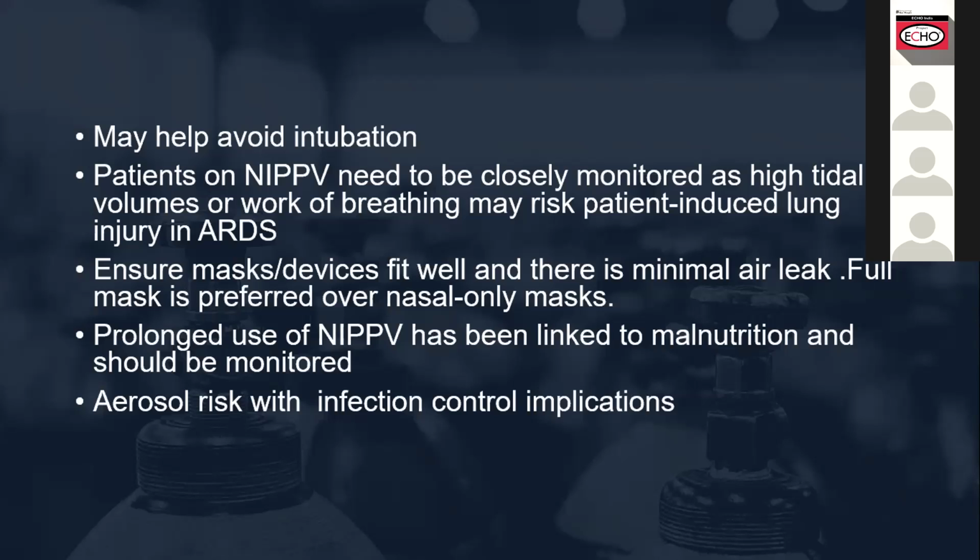Generally, you will prefer this method of oxygen supplementation if you judge it is going to be for a short period. But for a patient who is likely to require this mode of oxygen support for more than 48 hours, you can consider intubating them, or support them with a face mask with a non-rebreather, if it is helping you reach your targets.